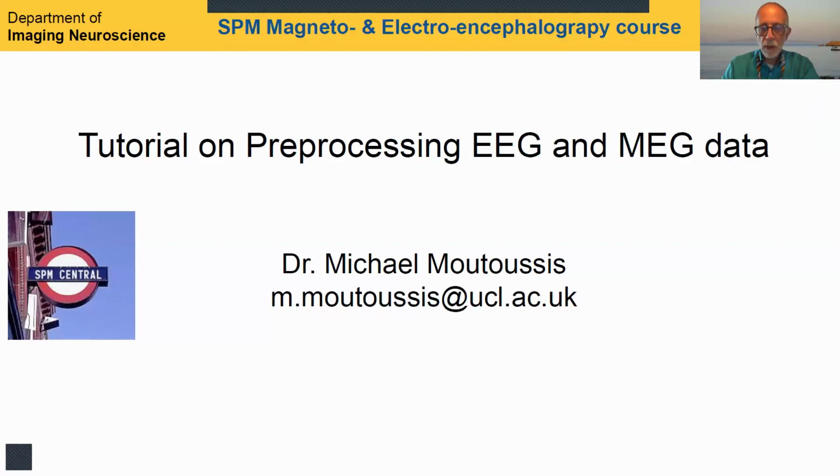Hi, I'm Dr. Michael Moutoussis, and I'm going to tell you about EEG and MEG pre-processing. This is a tutorial, and it is part of the SPM course by the Department of Imaging Neuroscience at UCL.